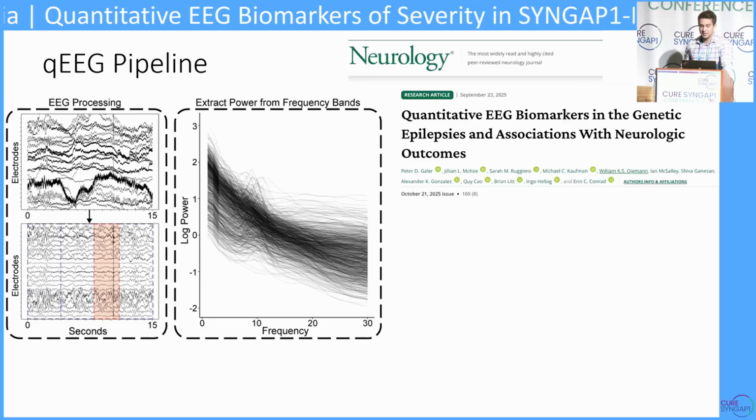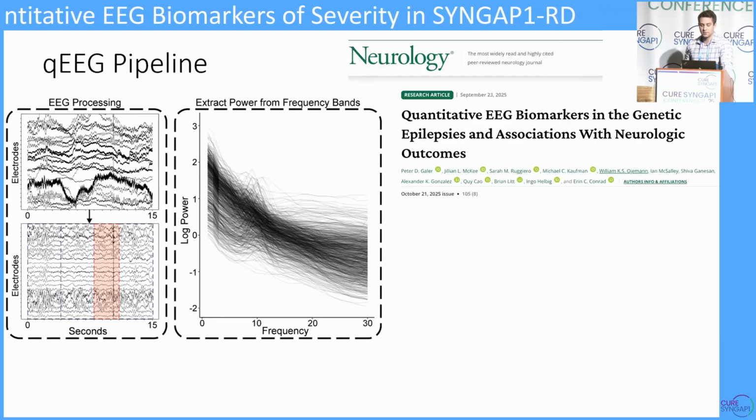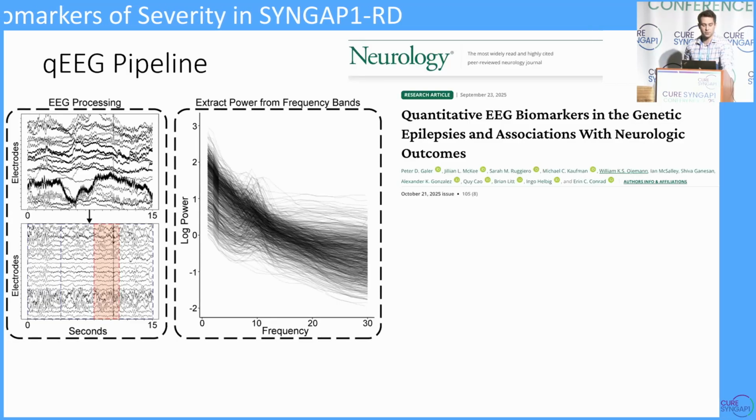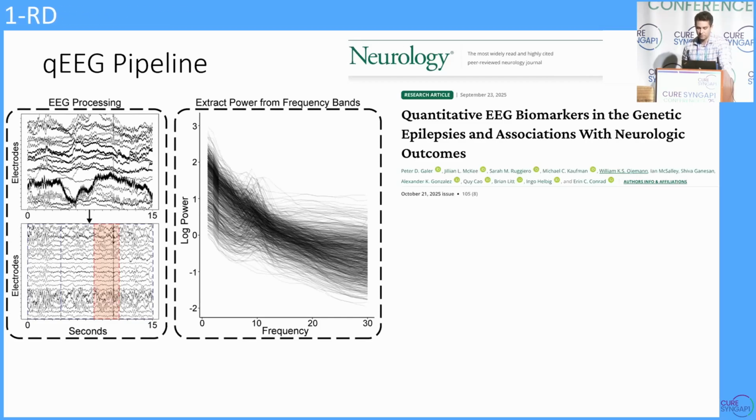After processing EEG recordings, the targeted monogenic cohorts and patients dubbed healthy controls after screening ICD-10 codes from electronic medical records, we conducted a battery of random forest analyses to create a classifier for each genetic etiology. I would encourage you to look further into this, but as Jay has done before, I will just show you the output of our Syngap model, which should look pretty familiar.